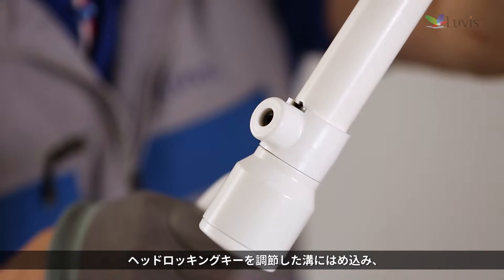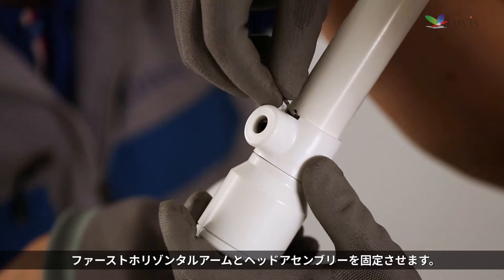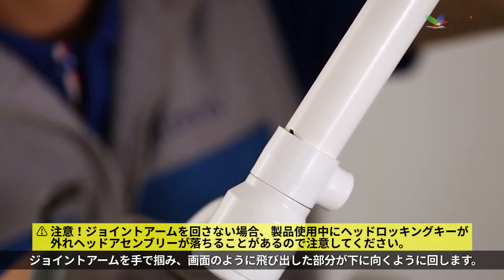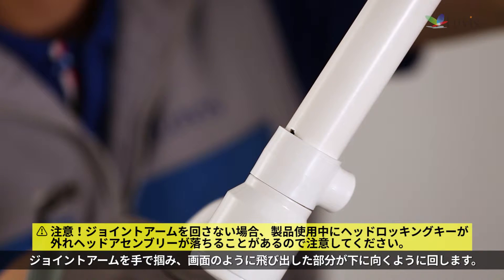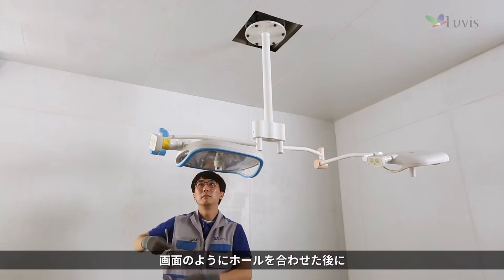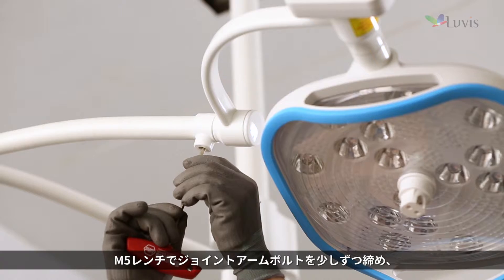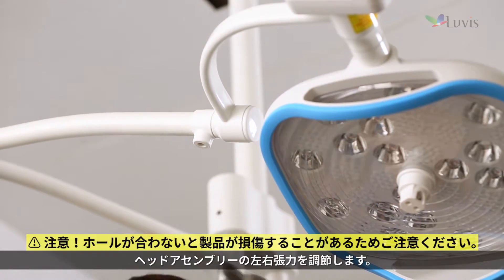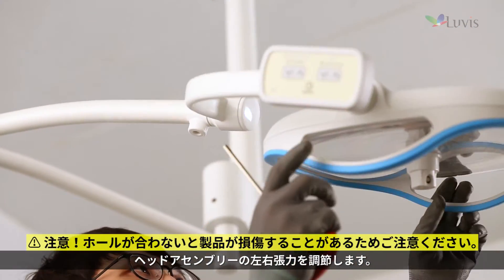Fix the first horizontal arm in the head assembly by inserting the head locking key into the adjusted groove. Hold the joint arm and rotate the prominent part to face down as seen on the screen. After aligning the hole, tighten the joint arm bolt gradually with the M5 wrench and adjust the right and left tension of the head assembly.